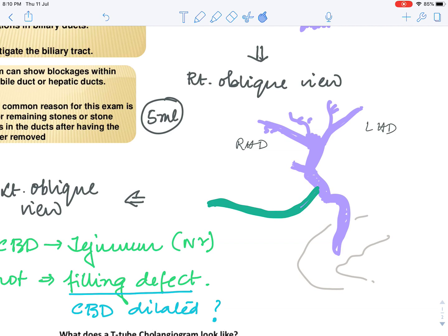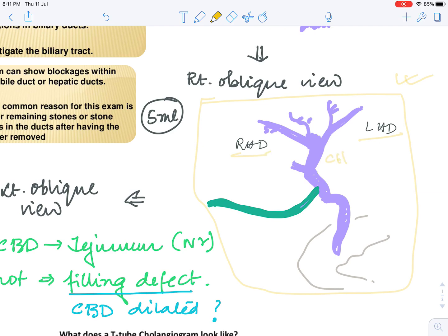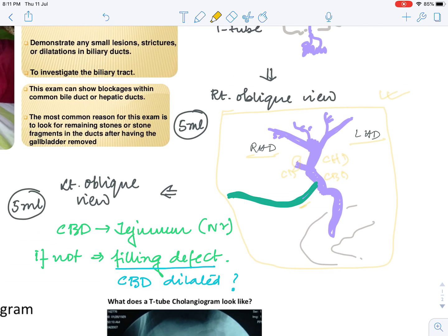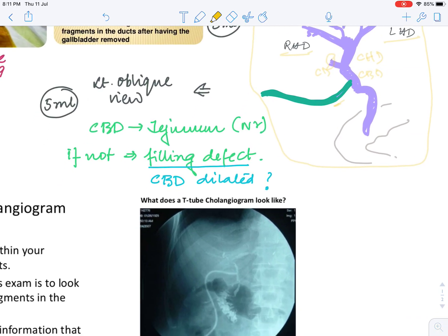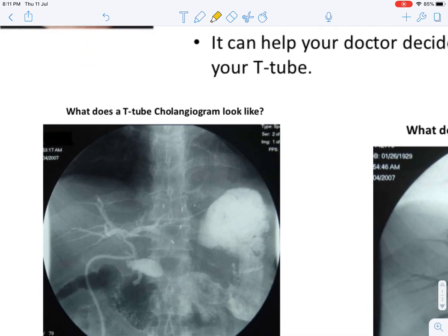Usually what surgeons prefer is the right oblique view, as it is the most informative and easy to interpret. The right oblique view shows the left hepatic duct, right hepatic duct, common hepatic duct, cystic duct stump, common bile duct, the T-tube, and the drainage into the duodenum. This view clearly shows any filling defect. Here we can see the left hepatic duct, right hepatic duct, the CBD, and the part of the duodenum where it drains.